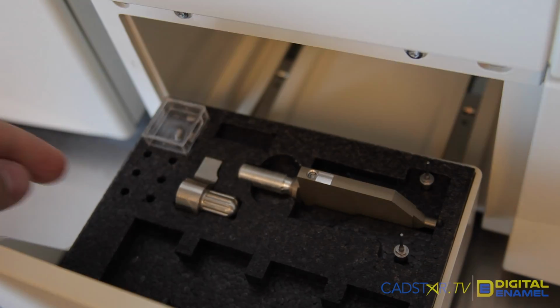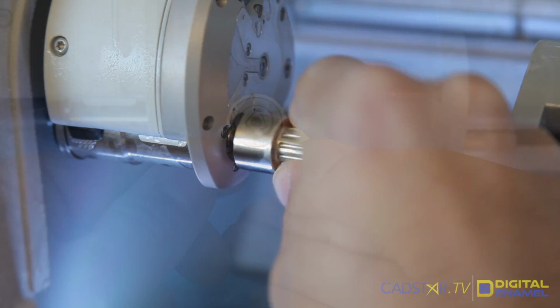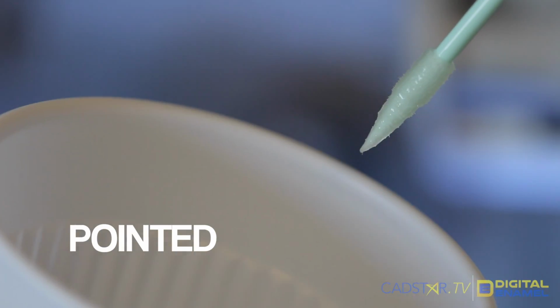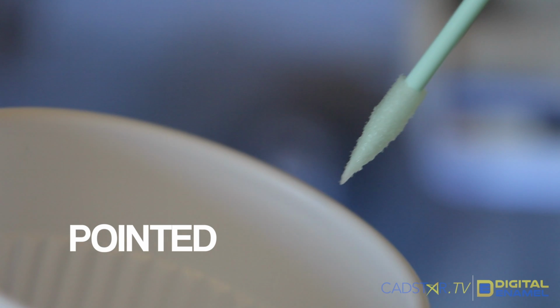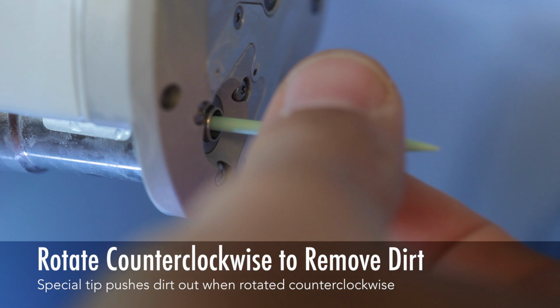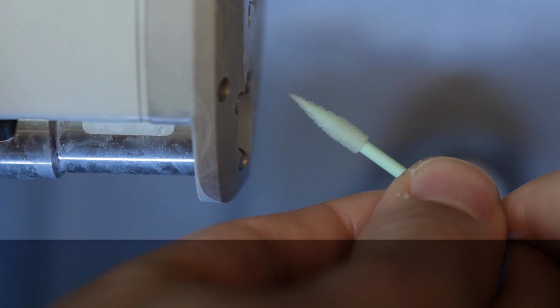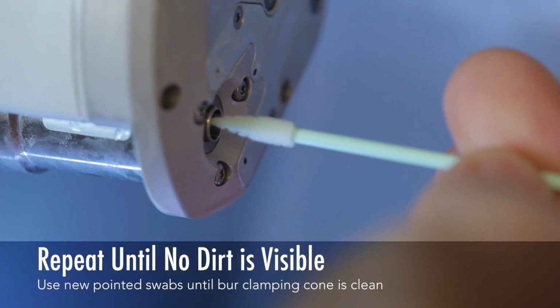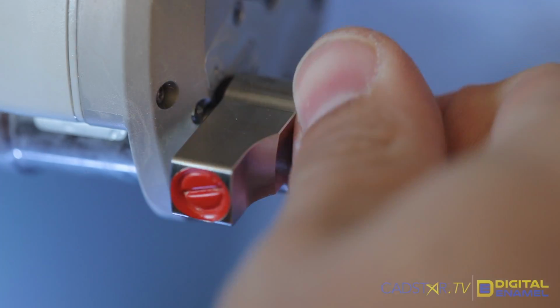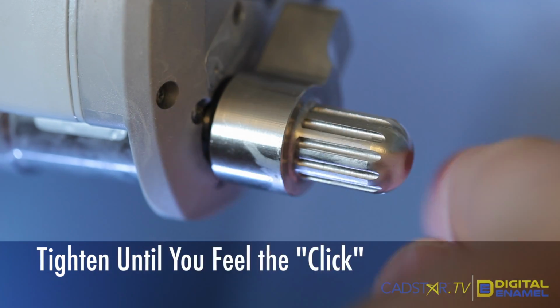In the drawer you'll find this little torque wrench, and this is designed to remove and to install all the burrs once they're in the right position. So we'll unscrew it and we'll take the pointed cotton tip applicator, dip it in alcohol, make sure it's not too saturated, and when we place it in the burr clamping cone, we'll rotate it counterclockwise. This pushes any dirt that there is out. And so you just repeat the process until it's clean and there's no visible dirt, and then you just put the burr right back in and use the torque wrench to install it and wait till you hear that click.